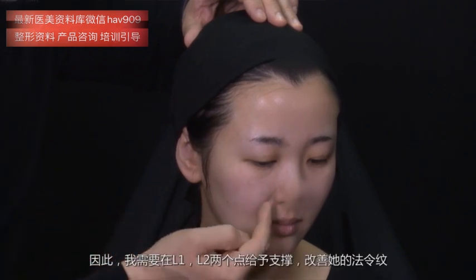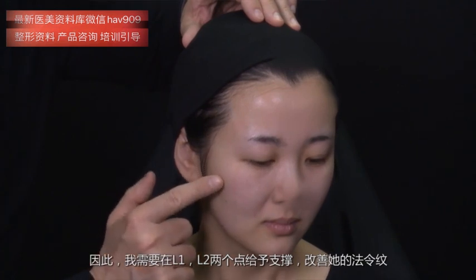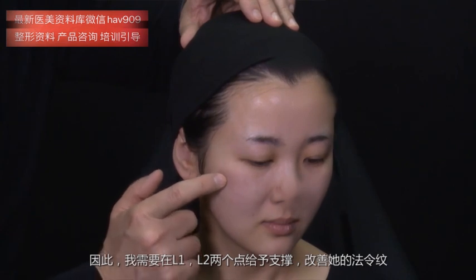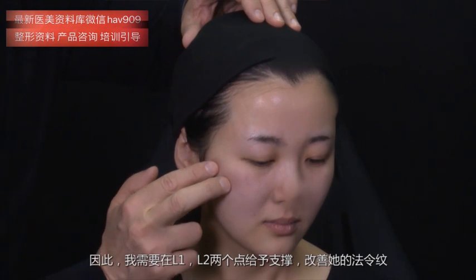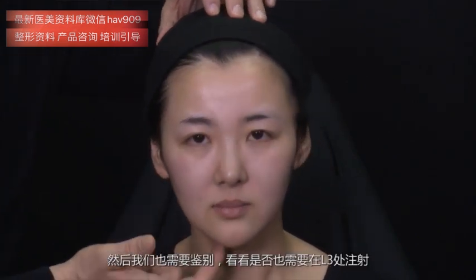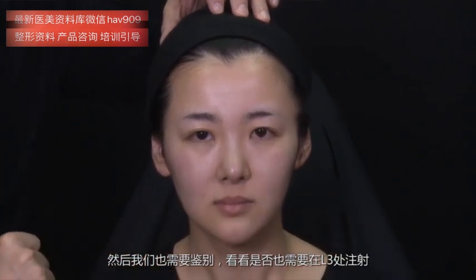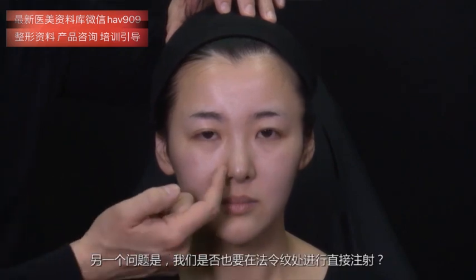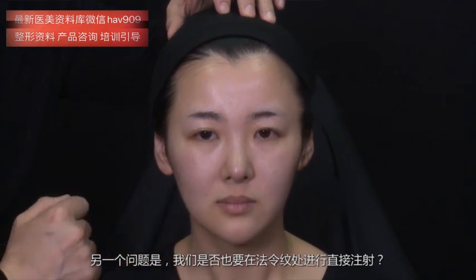So to improve the nasolabial folds, in her case, I needed to give support for the cheeks in the points L1, L2, and then we're going to verify if I also need to inject L3. The other question is, should we also inject the direct approach in the nasolabial folds?